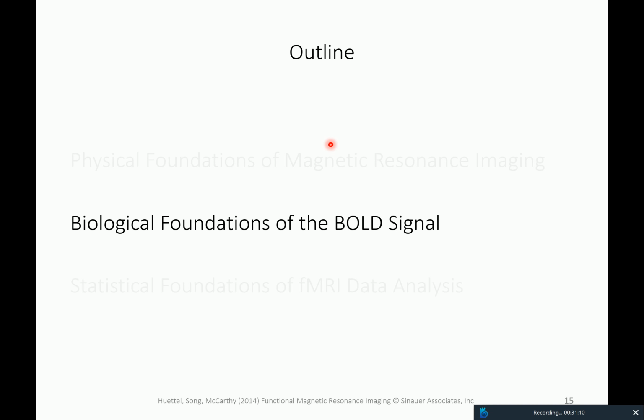So basically there's magnetic resonance and imaging, and the imaging part here relates really to the gradient coils. Now we will talk about this in more depth. Strangely enough, in these introductions to fMRI, I always find there's a bit more emphasis on the physics than there is in EEG.